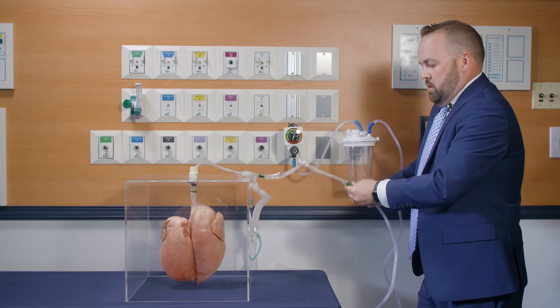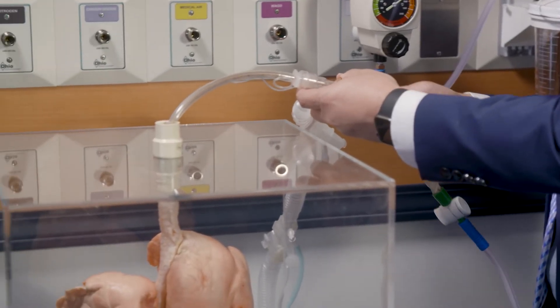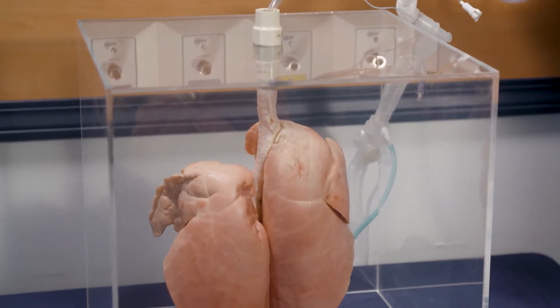So I'm going to apply suction here. We're going to insert the catheter into the lung. And now on the next breath I want to begin.